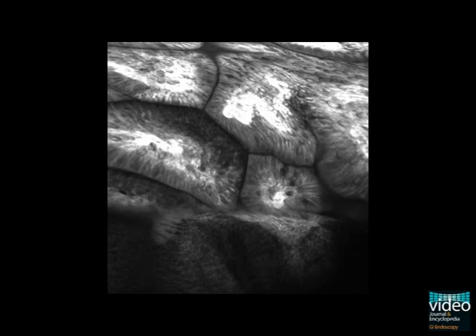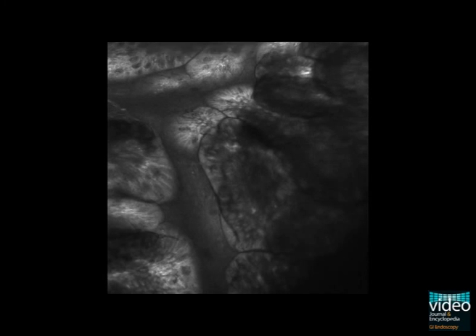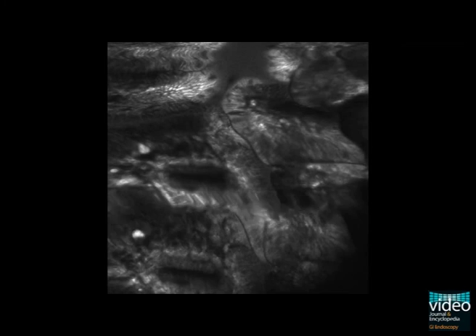Again, the strong contrast and extravasation of fluorescein into the lamina propria and the epithelium indicates enhanced vessel leakiness as a sign of gastritis.